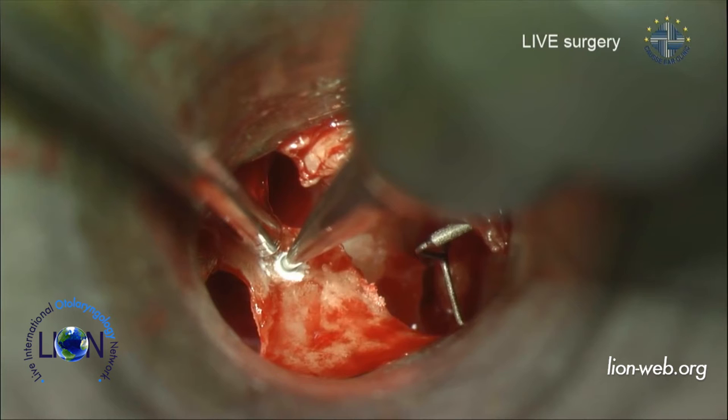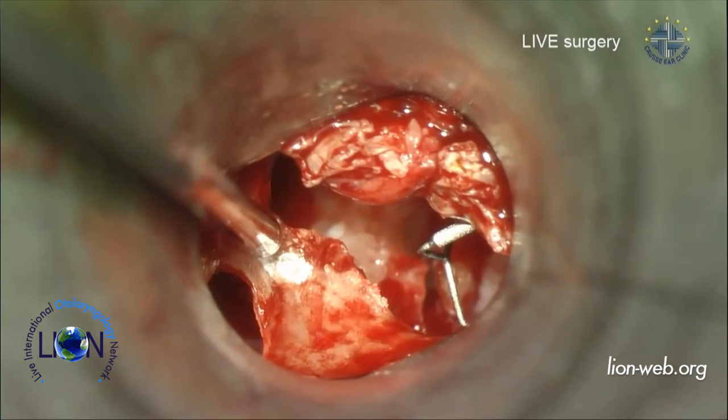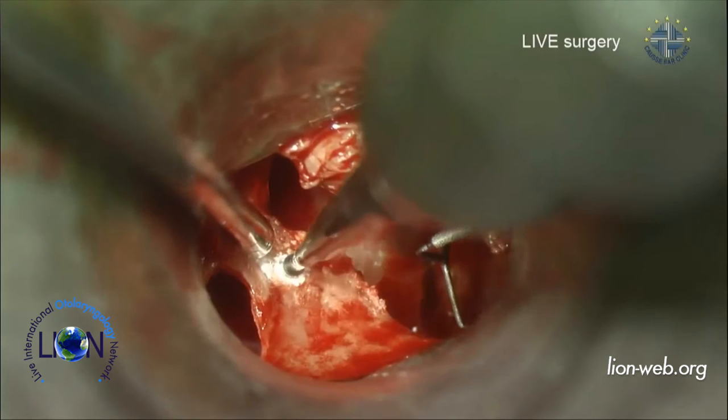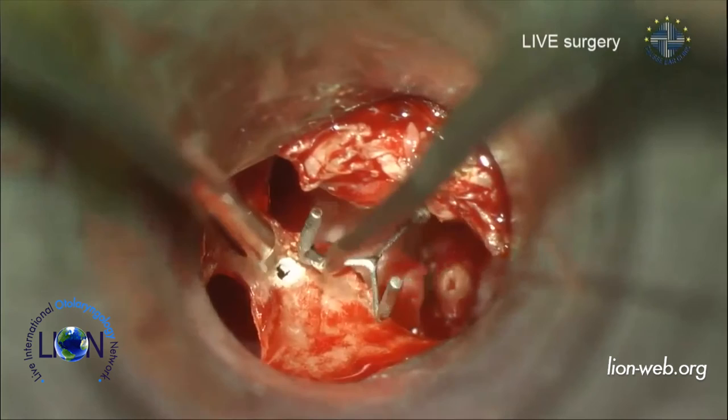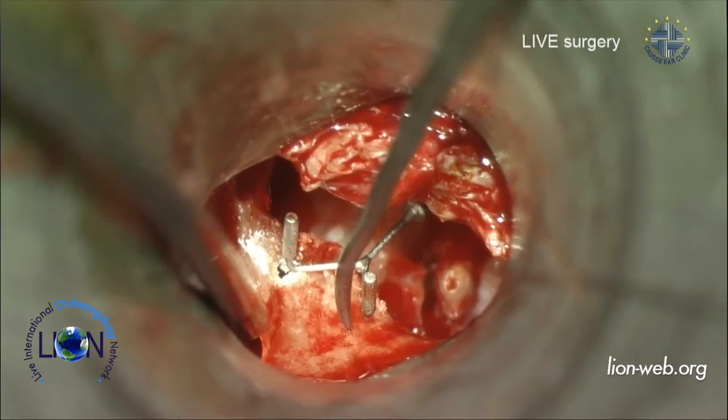So I'm not using the fluid irrigation anymore. Just a little bit like this, directly with the burr, because I feel that the hole is better if we do it directly like this. So the first one is fine. And we're going to do now the second one, which will be here. So just confirm that's a 0.6 millimeter hole and a 0.4 millimeter diameter. Yeah, exactly.